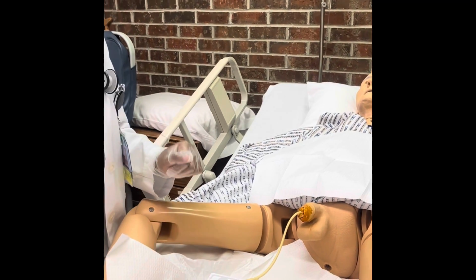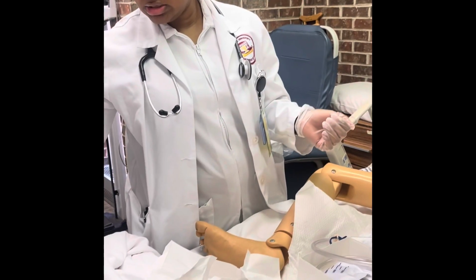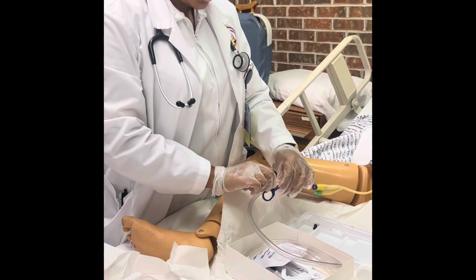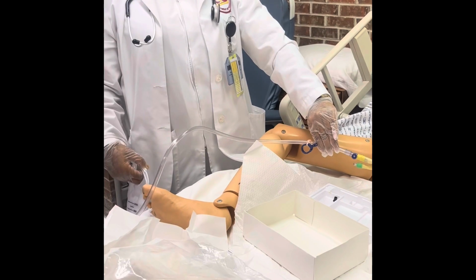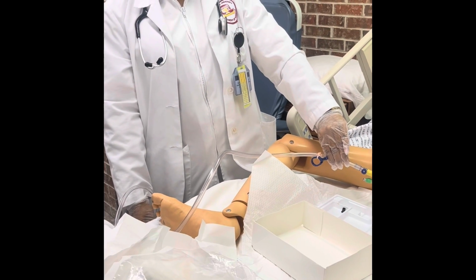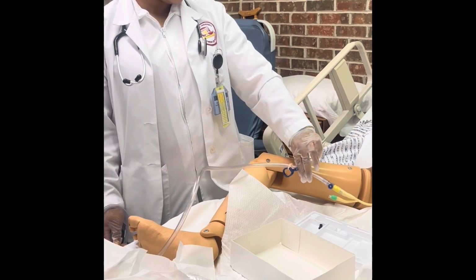Okay, next I'm going to collect a urine sample. I have some alcohol pads with me. First, I forgot to say, hang the bag low. Once you're done connecting that to his thigh, hang the bag low on the unmovable part of the bed. You don't want it to get snagged or tugged. And make sure it's always below his bladder.